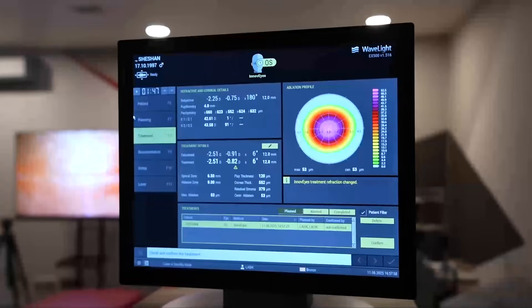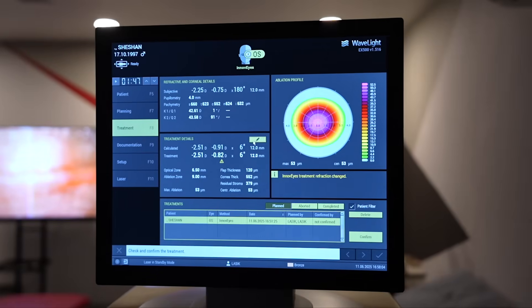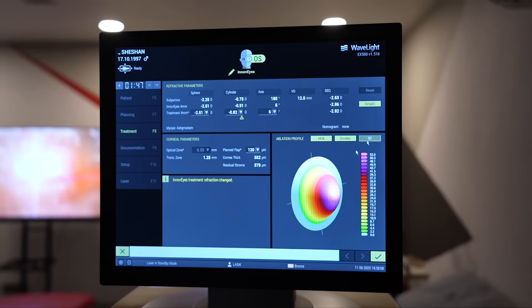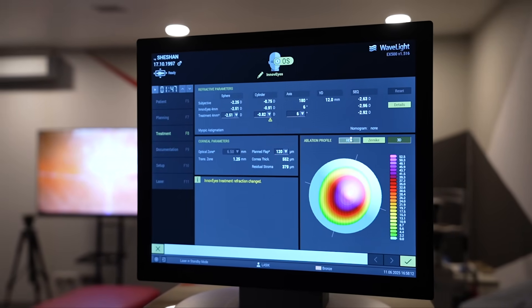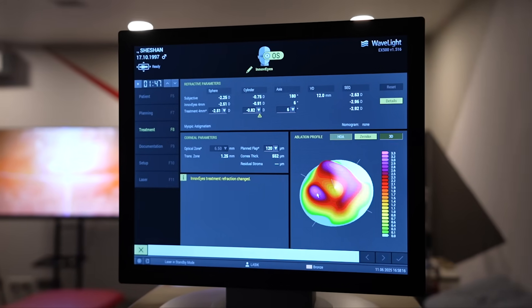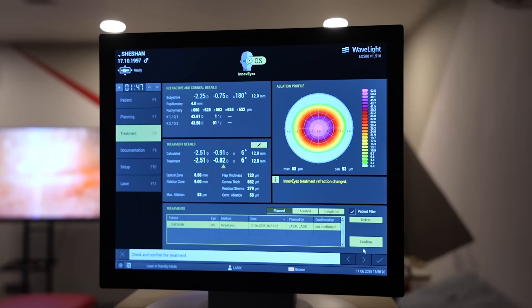We are ready to start with the procedure now. You can see these details on the screen — you can see the ablation pattern. I will show you this pattern in 3D as well, so you can see how the ablation would take place. I will also show you the higher order aberration map, so you can see how we are treating off all the aberrations of the eye.